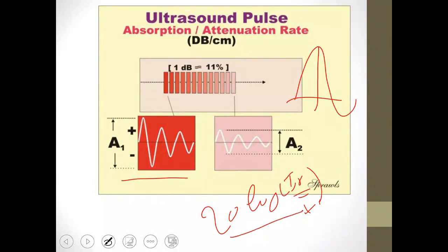Okay? So the reduction in decibels represents how much attenuation has occurred, how much intensity has been lost in the beam that is already produced by the transducer. We mentioned that it takes values like -1 decibel or -2 decibels because there has been a loss in intensity. The negative values represent that there is a loss that has occurred. This is the meaning of the term decibel.